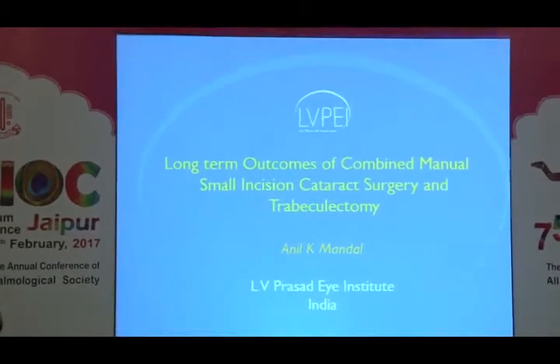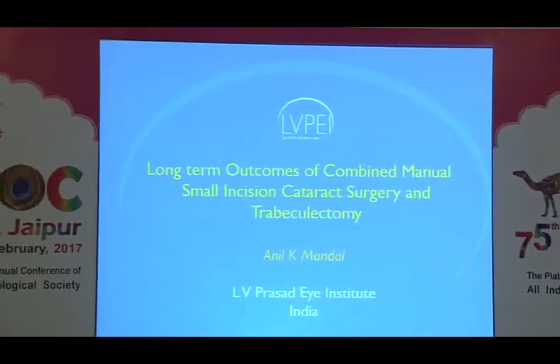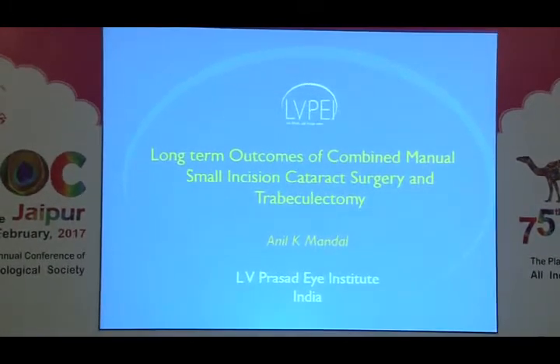whenever we plan to manage cataract and glaucoma in a combined surgery, we'll have to realize that cataract surgery requires a perfectly sealed incision, suture or sutureless. The wound should be in a situation that it will not leak. Compared to that, filtering surgery requires wound healing or suturing in a way that it should not close permanently, it should leak. So it's contradictory. And when we are combining the two, we'll have to be very careful. We want a controlled filtration and it will not create complication.